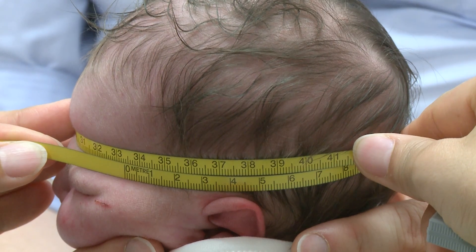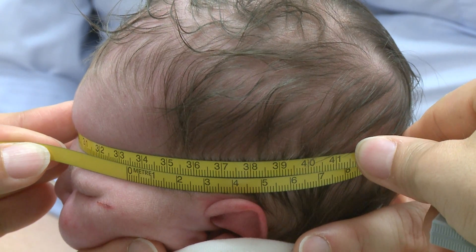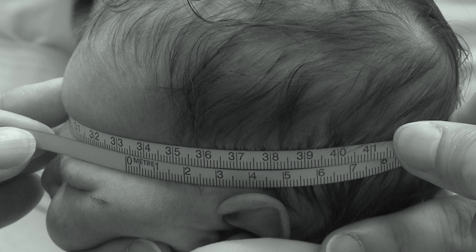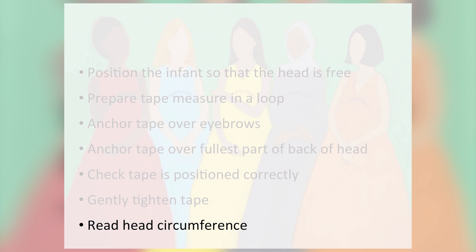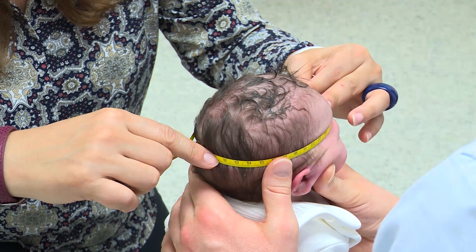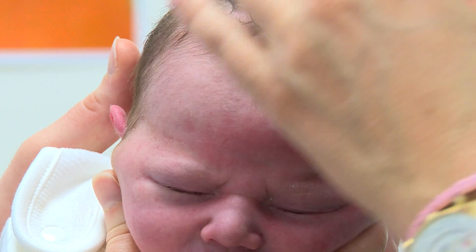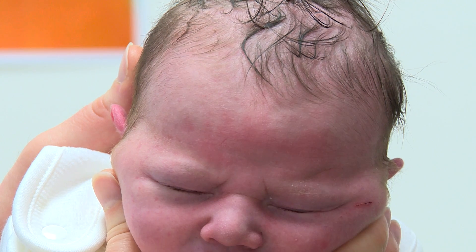The measurer records the measurement to the last completed millimetre. For example, this baby's head shows a measurement slightly in excess of 33.3 centimetres, so the measurement will be 33.3 centimetres. Once completed, the measurer carefully removes the tape off the baby's head. Any residual pressure marks should disappear within seconds.